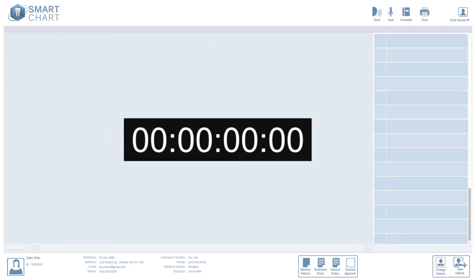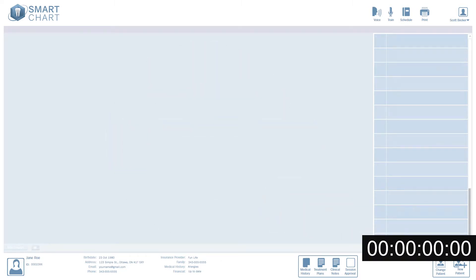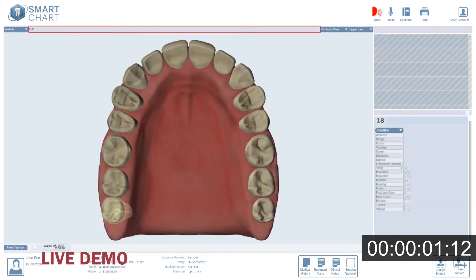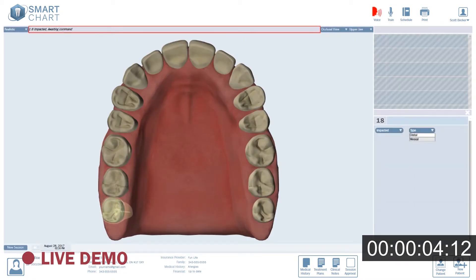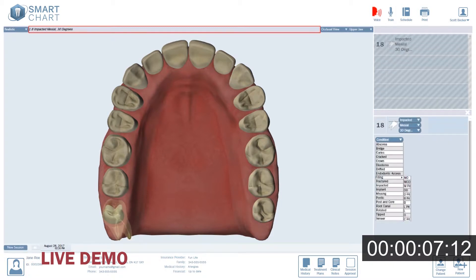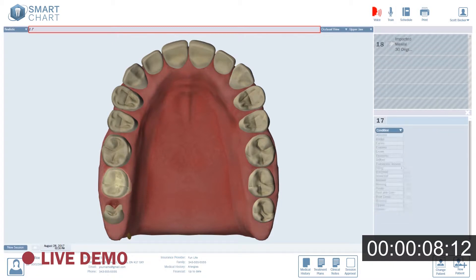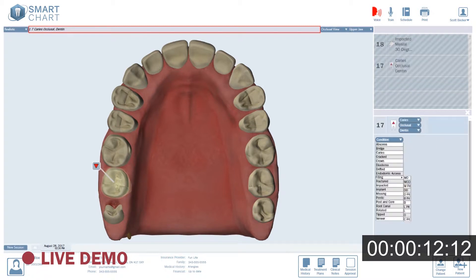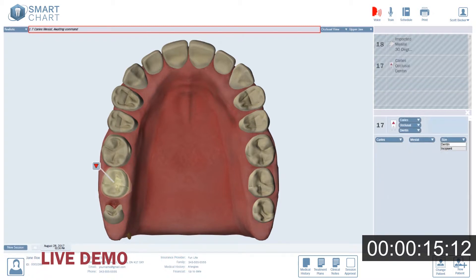Keep an eye on the timer in the corner of your screen. 1.8: Impacted, mesial, 30 degrees. 1.7: Caries, occlusal, dentin. Caries, mesial, incipient.